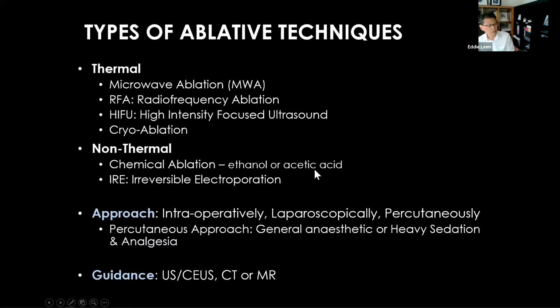But more recently, over the last 5-7 years, there has been an increased usage of irreversible electroporation as a non-thermal technique to ablate tumors where the location of the tumors, like adjacent to vessels or more vital structures like gallbladder or bowel, could be more tricky using the thermal technique because of potential risk of complications. So the IRE is reserved in those cases because it's a safer technique.